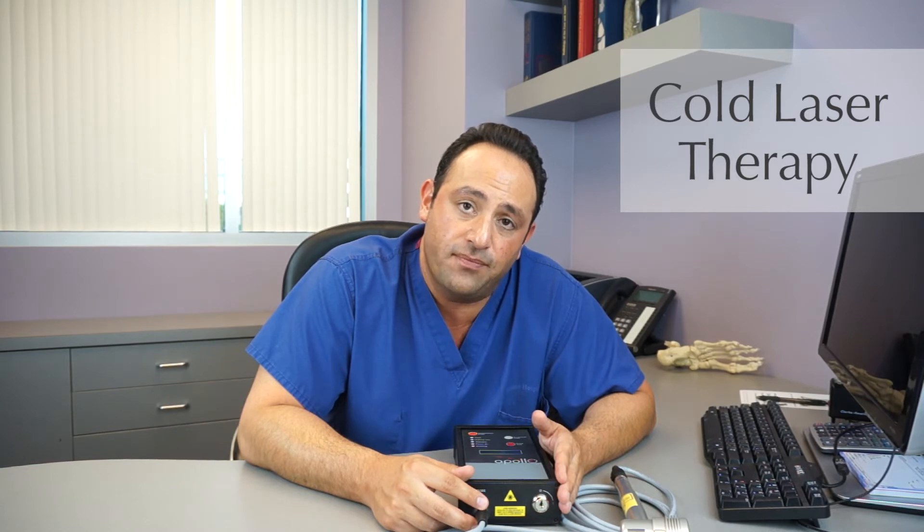Another question is: what is the difference between the cold heat laser and a hot laser? The hot laser burns and destroys tissue, while the cold heat laser on a cellular level decreases inflammation and initially decreases pain.